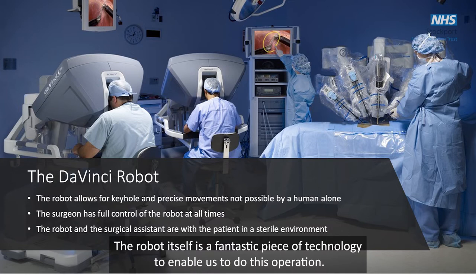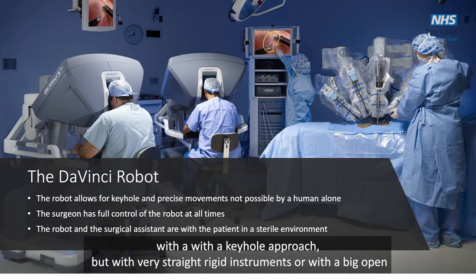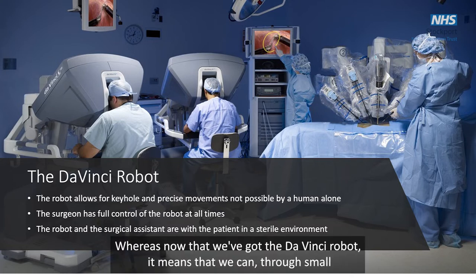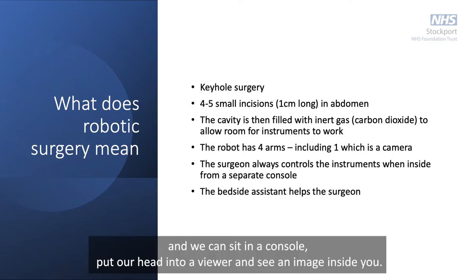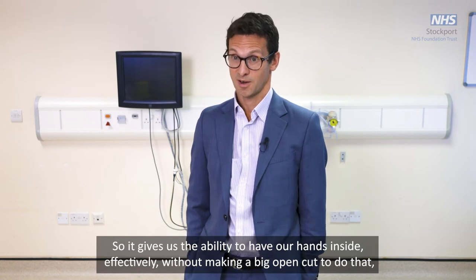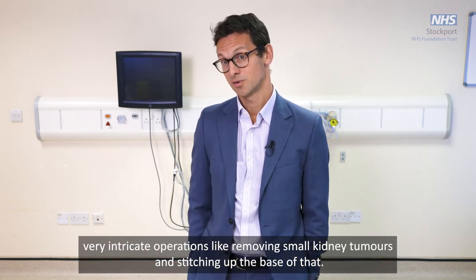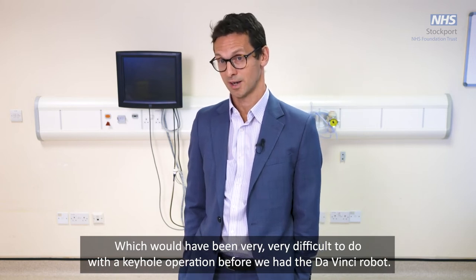The robot itself is a fantastic piece of technology. In the past we would operate through small incisions with rigid keyhole instruments or with a large open cut. Now with the DaVinci robot we can insert instruments through small incisions that have articulation at their tips. We sit at a console, place our head into a viewer to see an image inside you, and move our hands in small loops to move the instruments inside, effectively giving us the ability to have our hands inside without a large open cut.